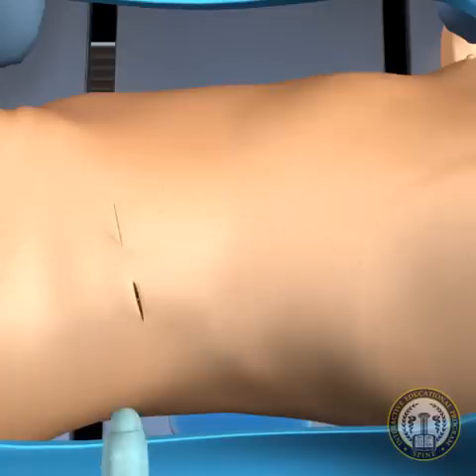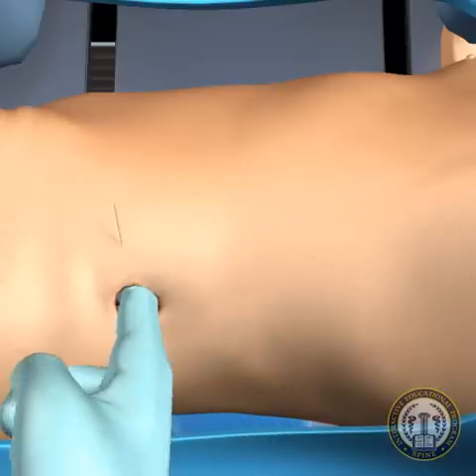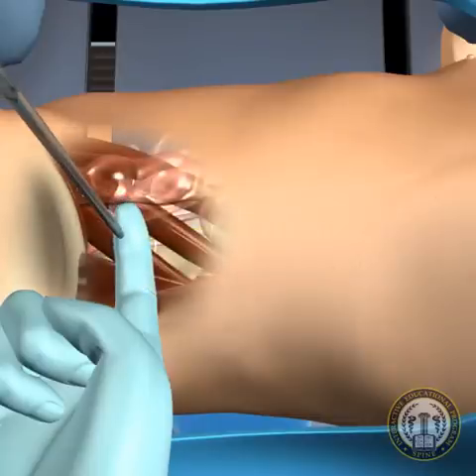By performing the finger dissection into the retroperitoneal space, a blunt dissector cannula may be safely passed through the lateral musculature directly into this potential space. With finger guidance, the dissector can then be positioned directly onto the lateral fibers of the psoas muscle.